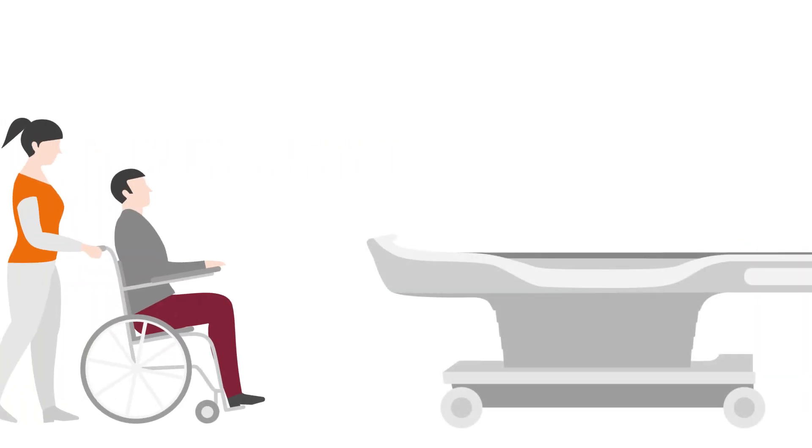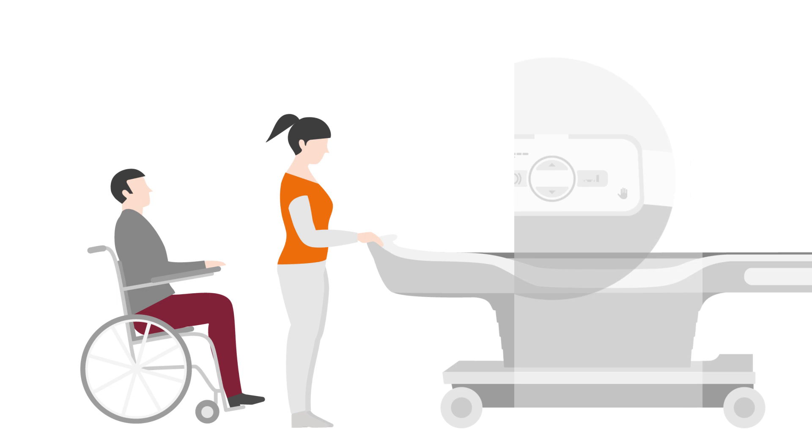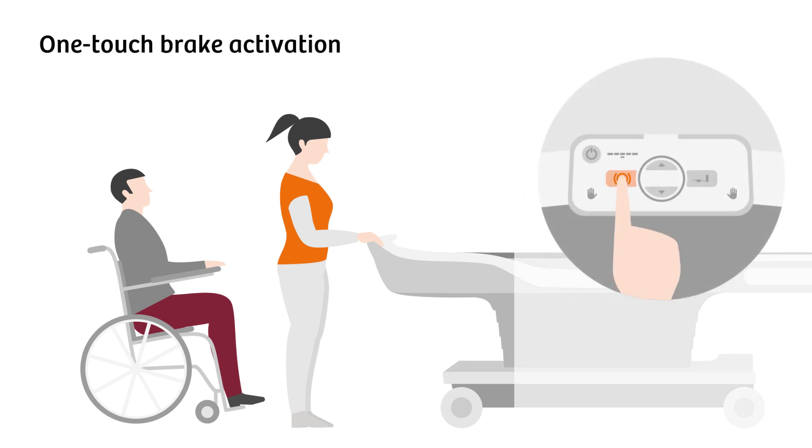The Biomatrix dockable table with eDrive eases patient transport to and from the scanner. The table's brake is activated with one touch for secure and easy table fixation.